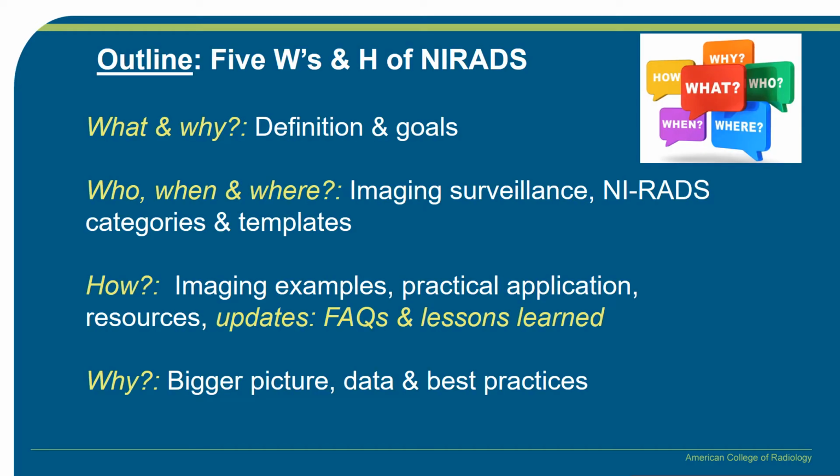We're going to start with the definition and the goals of NI-RADS, and then move on to who and when and where we should be using this template. And finally, we're going to spend the most time on practical application and imaging examples, along with some frequently asked questions and lessons learned.